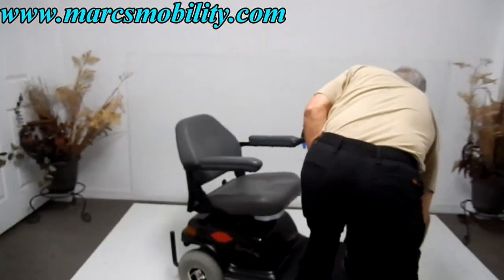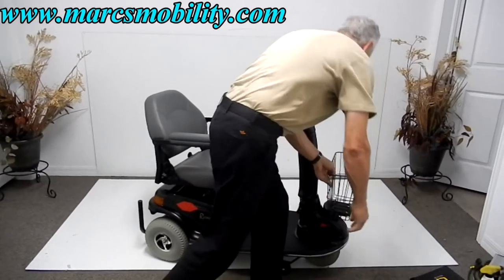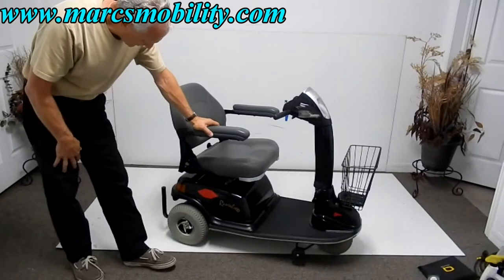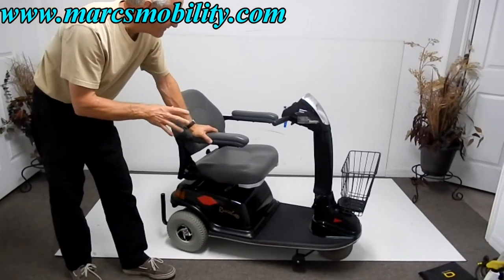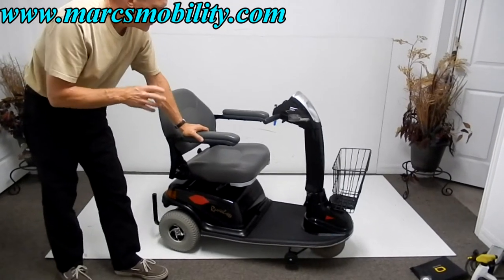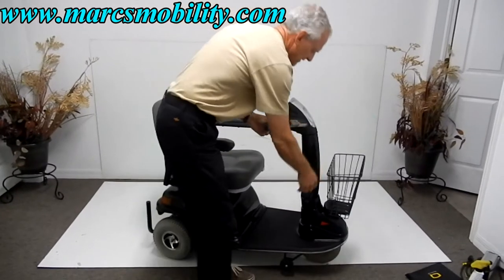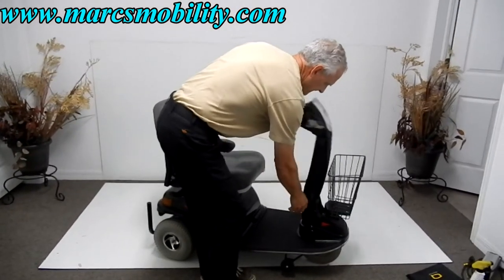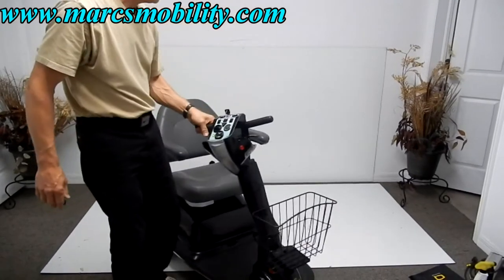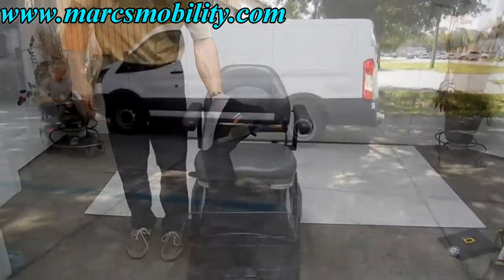This scooter is in fantastic, excellent condition. On a scale of 1 to 10, I'd give it a 9, with 10 being brand new. It has a great bumper, goes about 5 miles per hour, and provides a very smooth ride. You can lift the seat up when you exit, and the tiller is adjustable with the bar and handle. If you're looking for a real nice, easy-to-drive scooter, this would be a really nice one.